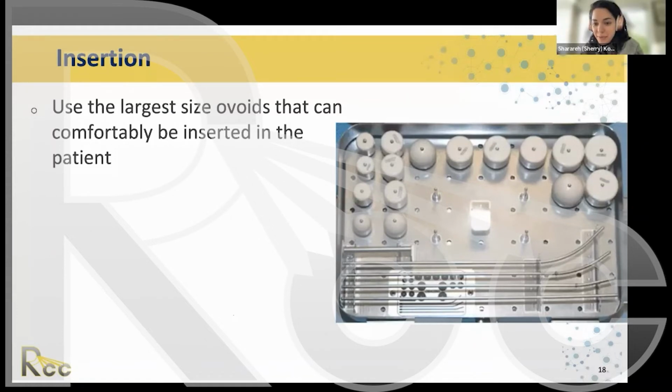And we do have some other great questions, if you don't mind, Dr. Brown. Stefan is asking, does the patient have to go through an operation to mend the uterus in case it's pierced through? Great question. So the uterus is a lot like the mouth. It heals itself incredibly quickly. So the patient does not have to go through an operation. It's actually not that big a deal. Radiation oncologists don't like to do it because they feel like they've failed at their task, but it's really not a big deal at all. So no operation, nothing, no.